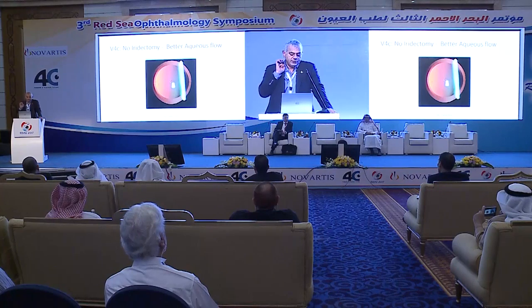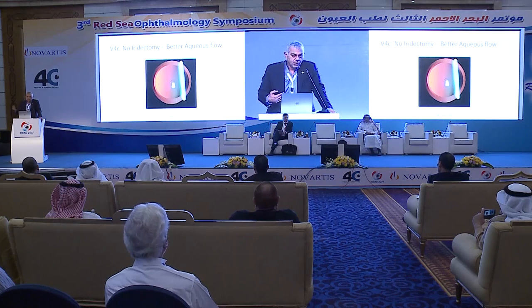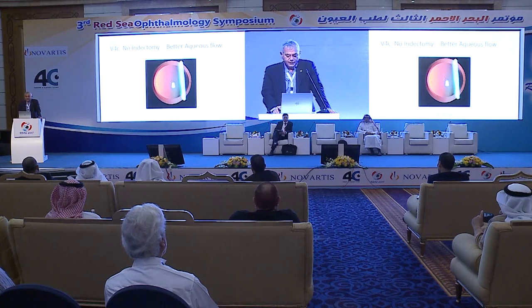With the V4B, my incidence of cataract was 0.5%, which is very low. With the V4C that we started using a couple of years ago, I did not see any case of cataract so far. In about 1,000 eyes, half of them at least completed 1 year follow-up with no cases of cataract so far. And I think that the central hole of the V4C improves the aqueous flow. It doesn't go through the iridectomy, but it goes through the center, which is more physiological. So I think this helps a lot in prevention of cataracts.